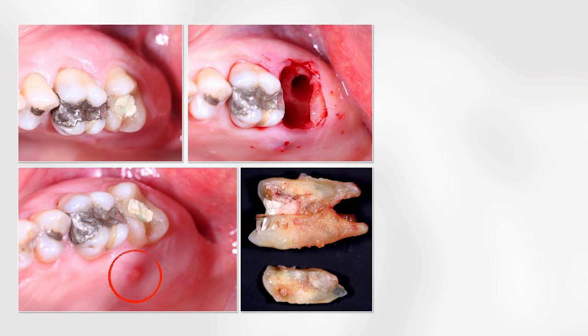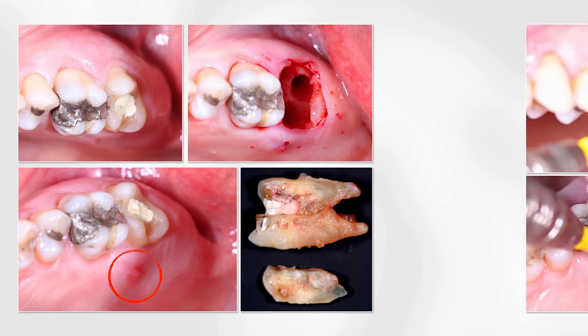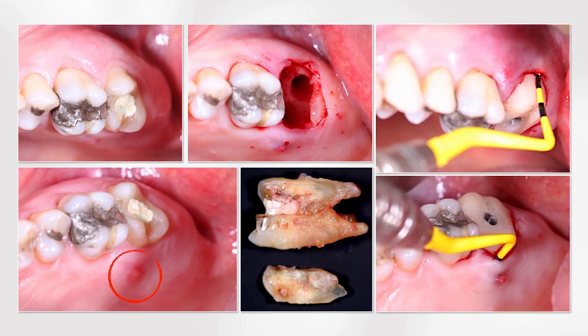And how about the implant position? We have to insert the implant at the interdental septum. The implant was placed, and the provisional crown was made, a screw-retained provisional restoration. Take a look at where the hole of the screw-retained provisional restoration was placed: exactly in the middle of the crown, in the buccal-palatal direction and the mesial-distal aspect.